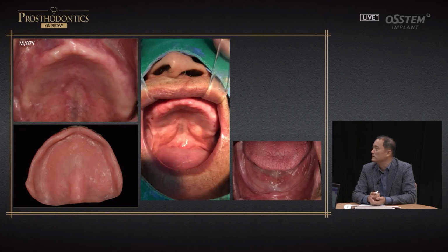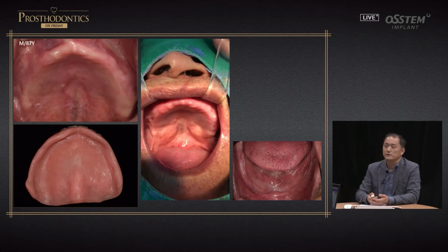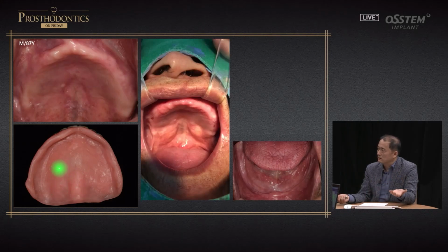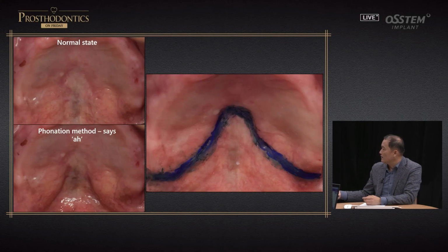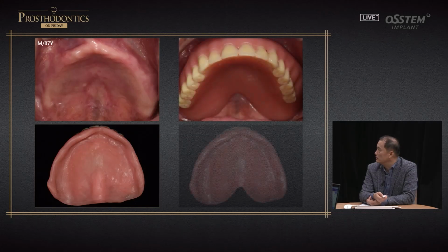This is another case. And for me, I also thought this was very interesting, because this area with the pronunciation of ah, there was a loss. In the beginning, the denture he had with him had maximum extension. At our clinic, we thought this was a bit too excessive. But in the beginning, we went with a similar approach. So we tried to control the load, but that was not the answer. Ultimately, what we opted for was to follow the AH line. We formed this along the AH line, and the denture we created resulted in actually better retention.